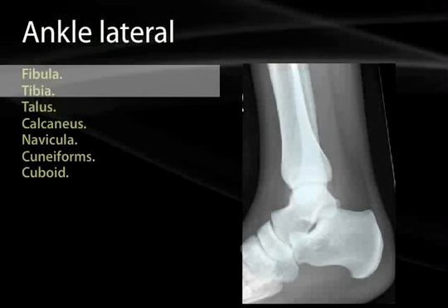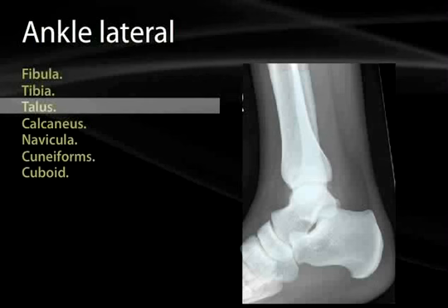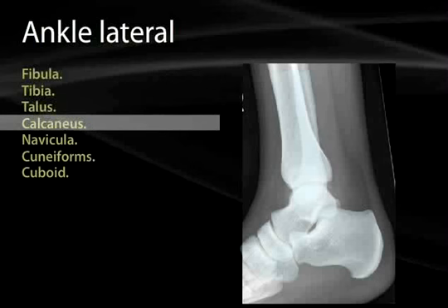On the lateral view you can see the same structures, though the fibula overlays the tibia. This view gives a much better look at the talus and is used to measure subtalar fractures or fractures through the neck of the talus. The narrow portion of the talus just before it articulates with the navicular bone is susceptible to fractures.